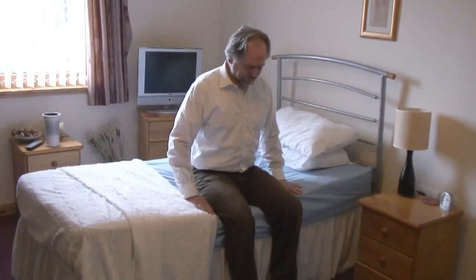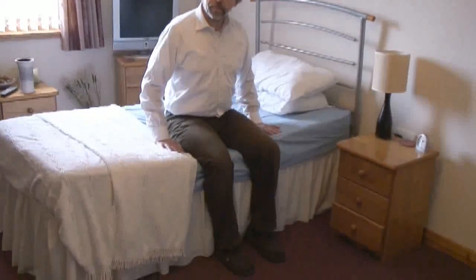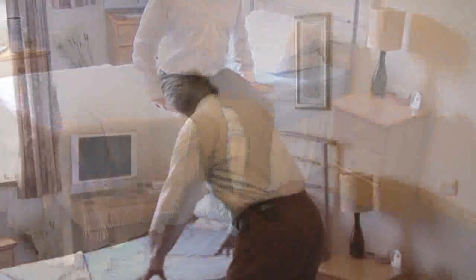The bed really is not a bad height for you, Charles. Your feet are firmly on the ground. Your hips and your knees are pretty much in line. So I would say that bed is quite a satisfactory height for you.